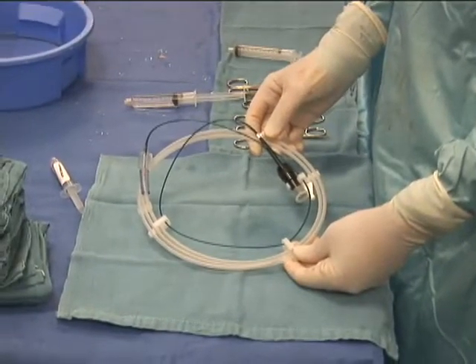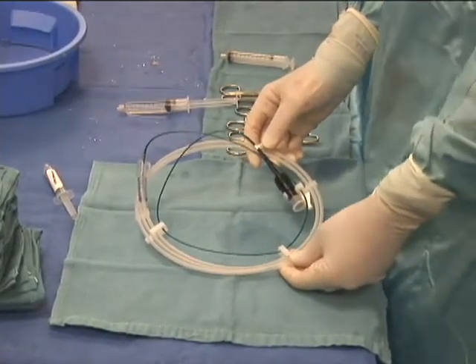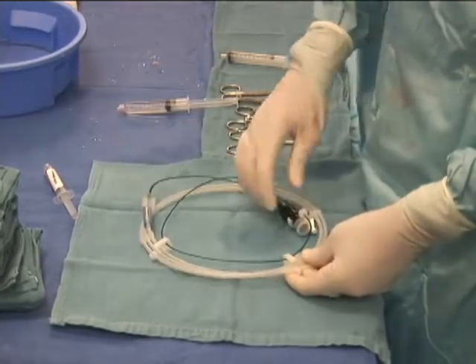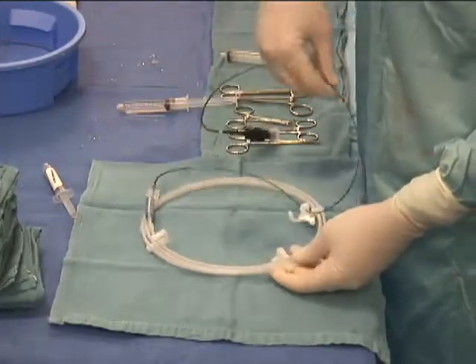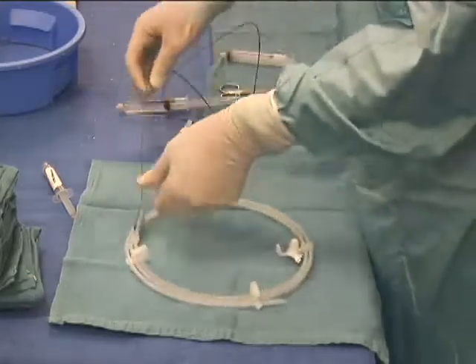In this example, a phased array IVUS catheter is used. The catheter is removed from the plastic storage hoop. The distal 1 centimeter of the catheter is where the phased array portion of the IVUS imaging catheter is located. The tip of the catheter is flushed with heparinized saline.